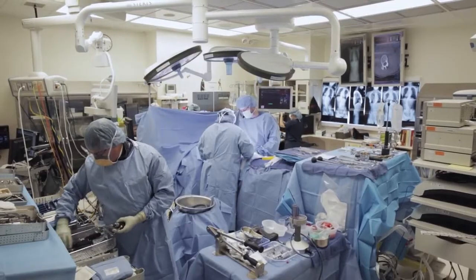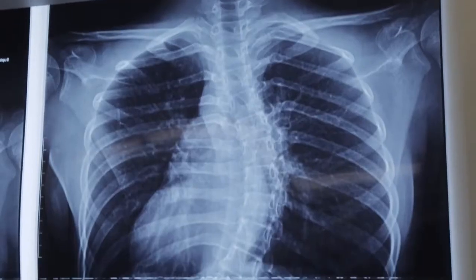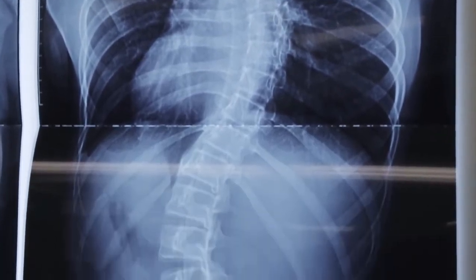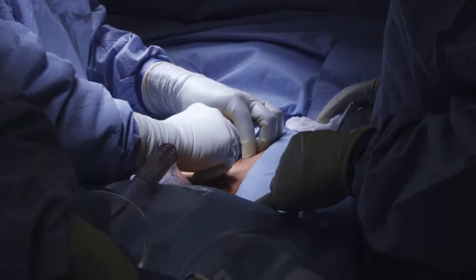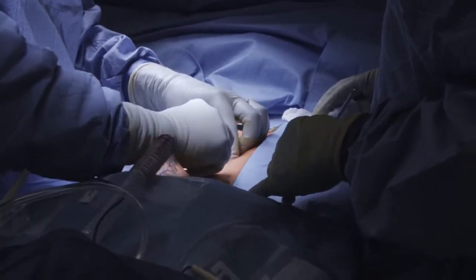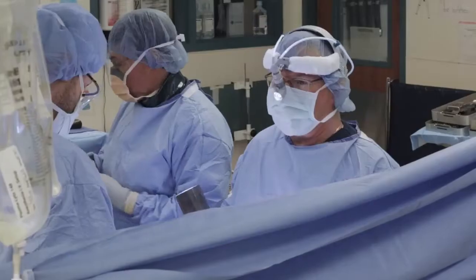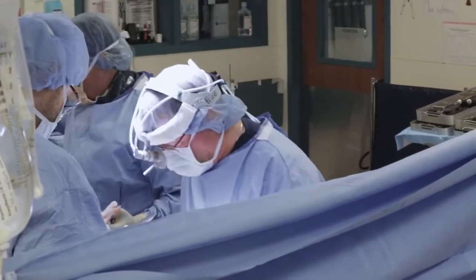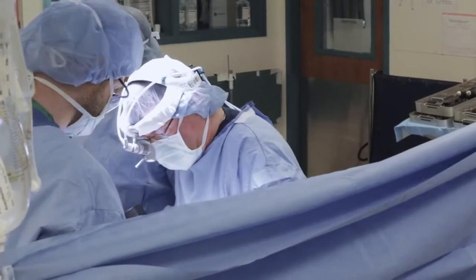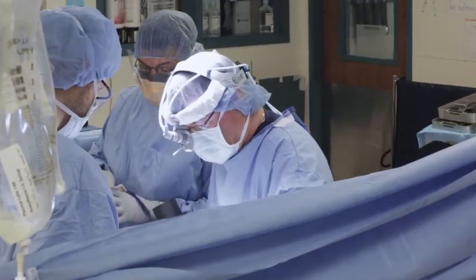For her scoliotic curvature, the goal is 60 to 80% correction. Gonna go through the skin, and then we basically elevate the muscles away on either side and expose all the bony elements from the top to the bottom. So what I'm doing now is I'm using this bone chisel, and I'm just gonna take some of the joints away. That'll allow us to loosen up the spine. Also, it's a source of bone graft, which is good when you're fusing something.